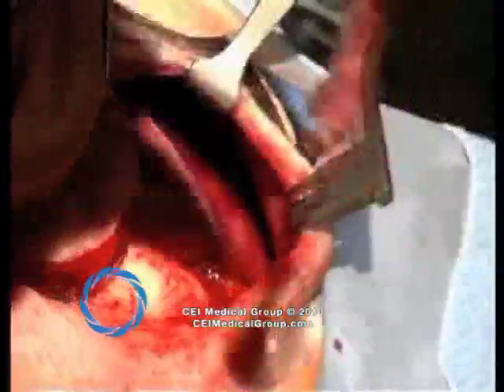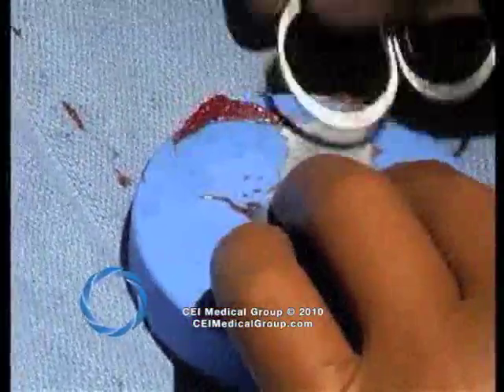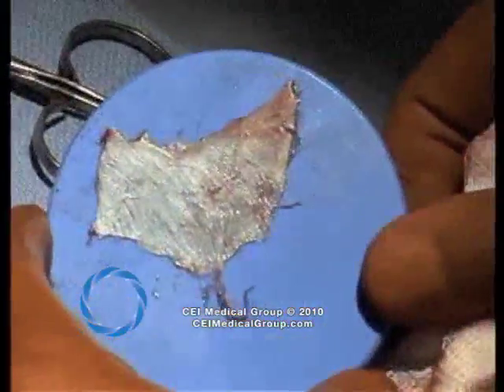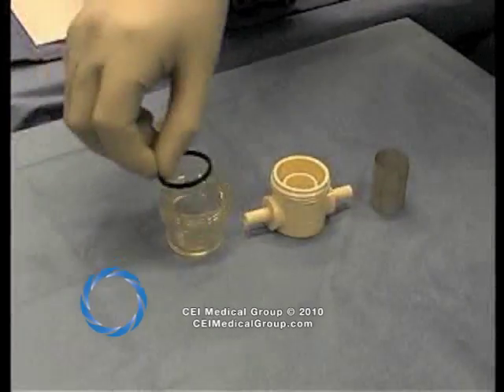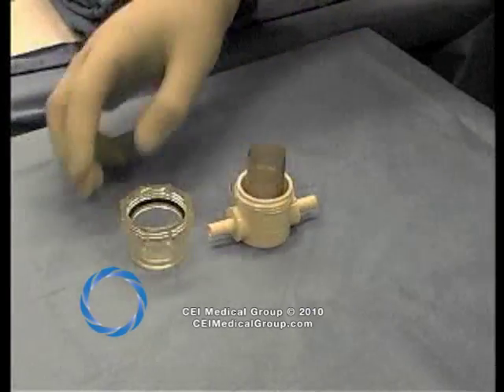The fascia is placed on a delrin block and any musculature attachment is removed. The size of the fascia is much bigger than usual with a tympanoplasty. The fascia is allowed to dry, and the bone pate collector with the rubber seal, the mesh screen, and the cap is assembled.